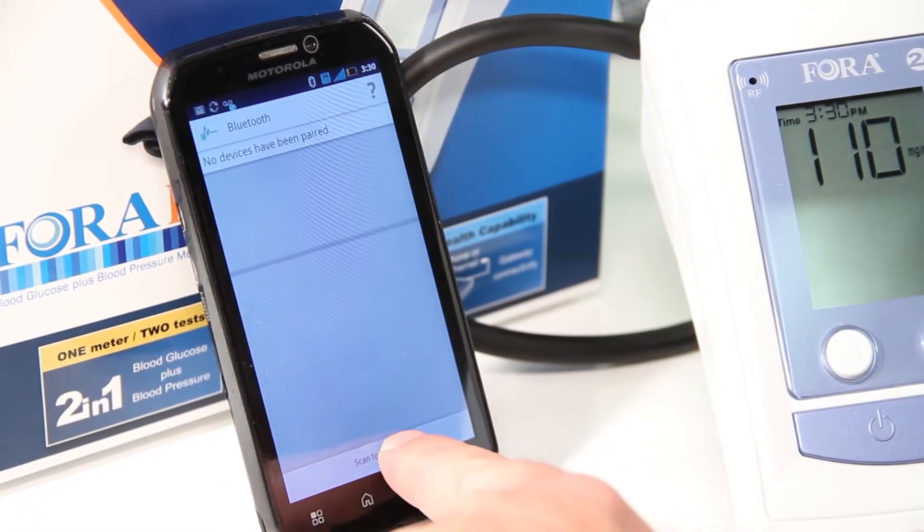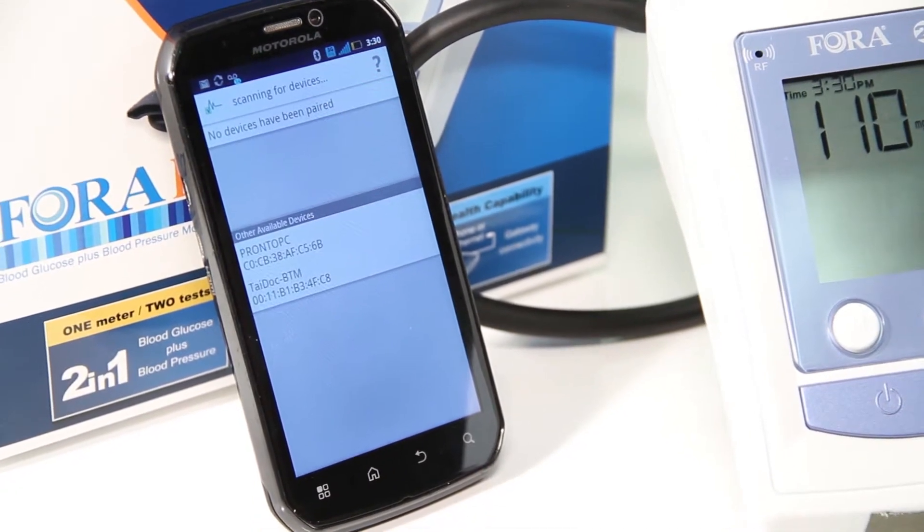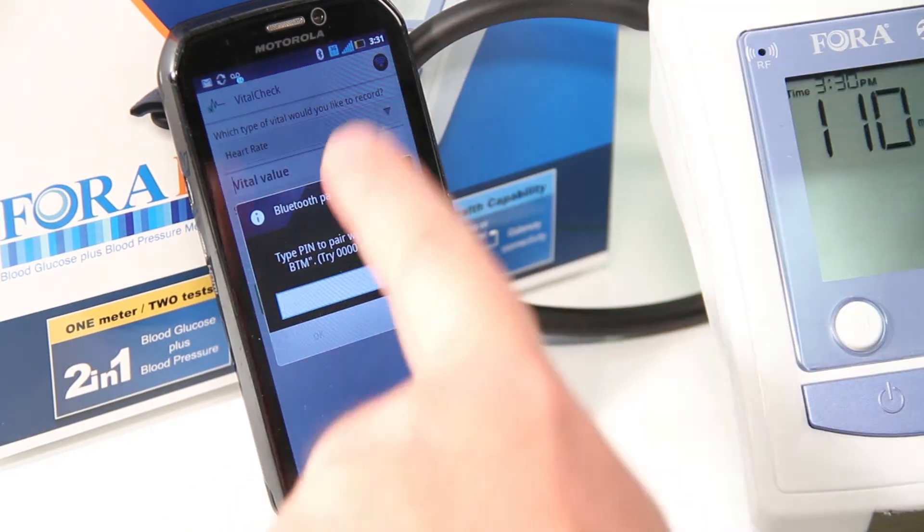At the bottom of the screen, tap scan for devices. Select TIDOCK BTM and enter the number one six times for the pin.